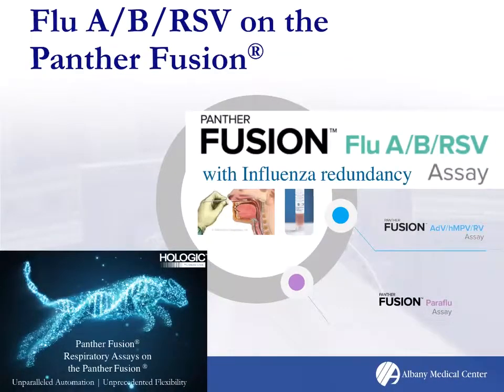So we were doing an analysis on the Panther Fusion, particularly the Flu A/B/RSV assay. As I mentioned, Hologic has chosen to use a modular syndromic approach so that you can choose the tests that are right for the patient population.